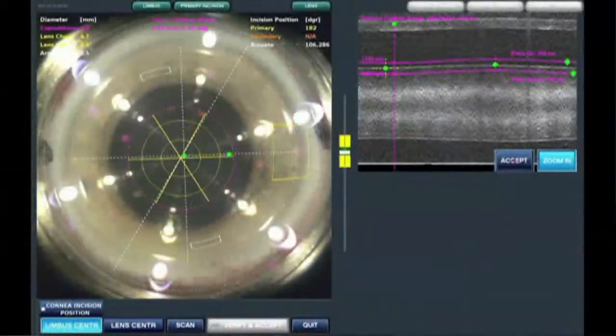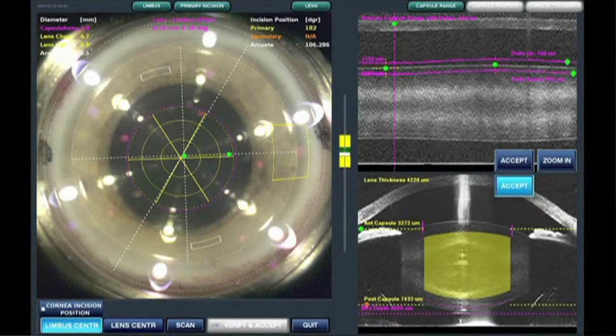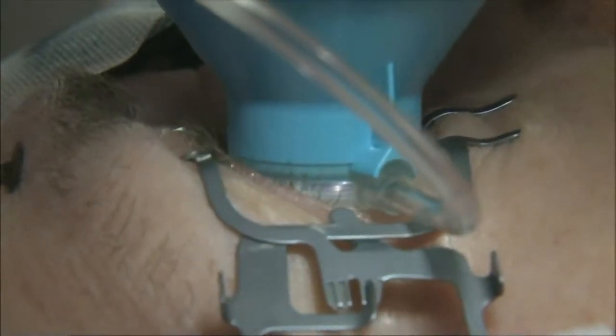There have been a number of very important improvements in the technology since we've been using it. The enhanced OCT image obviously is a great improvement. When we first had the OCT technology early on, it was really gee whiz, wow, we can see the eye. And then as it got better, we're like, wow, we can see the eye in amazing detail. So we're really getting spoiled by the level of just amazing visualization that we can now have for these patients. The flexibility of making the incisions, the ability to tailor the incisions has continuously improved, doing different types of incisions, different types of arcuates. All these things have gotten better. There's been more things we can do and better ways to do the incisions.